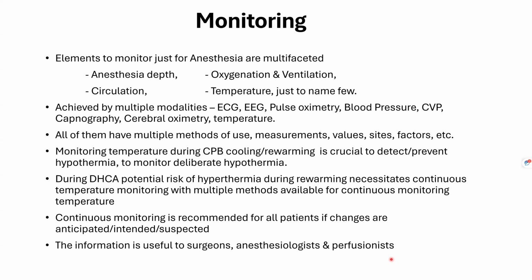Again, what is monitored and what is not monitored varies based upon the different centers. But whatever I have mentioned are most of the basic things that I believe most places do monitor. So as I said, it's temperature monitoring and the EEG. All this information is important to decide how long they can stay, how quickly they have to finish, or how quickly they can come off. Even after they come off, how they are rewarming, how the brain is responding, and all those things.